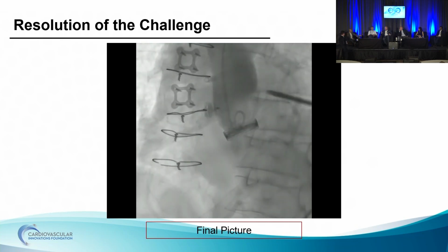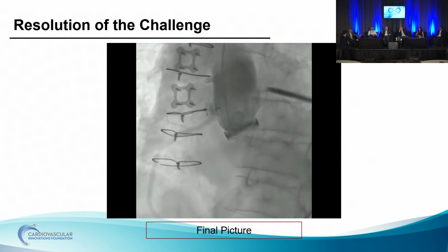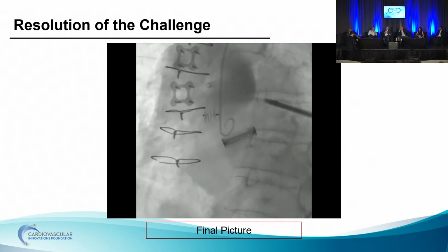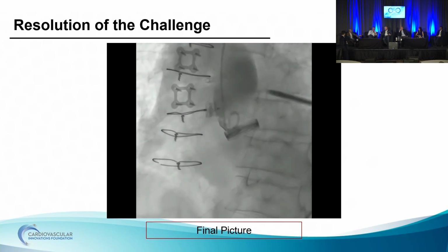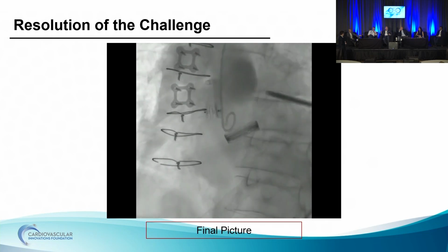But the discs, here you're just trying to balance occlusion versus occlusion of the flow into the pseudoaneurysm versus occlusion of the right coronary. So having disc-based devices may be a terrible choice. So this could be as good as any.